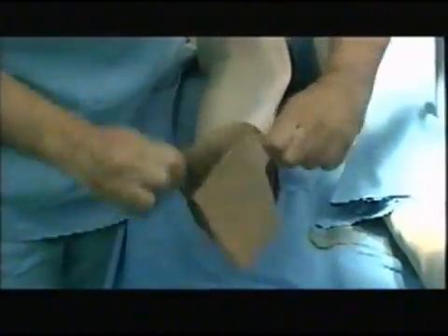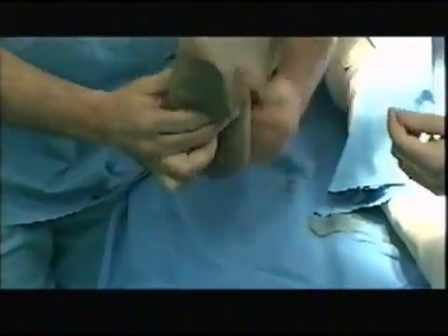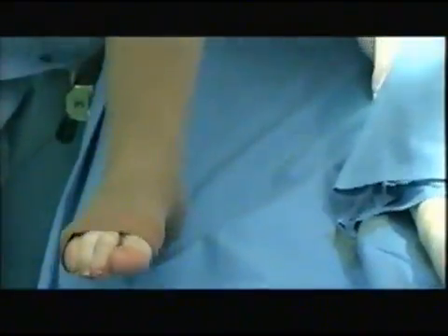Elastic stocking is used on the other leg in the interval between the first and the second contralateral operation.